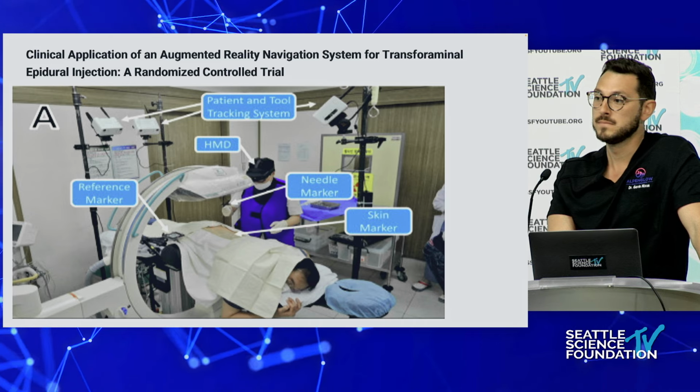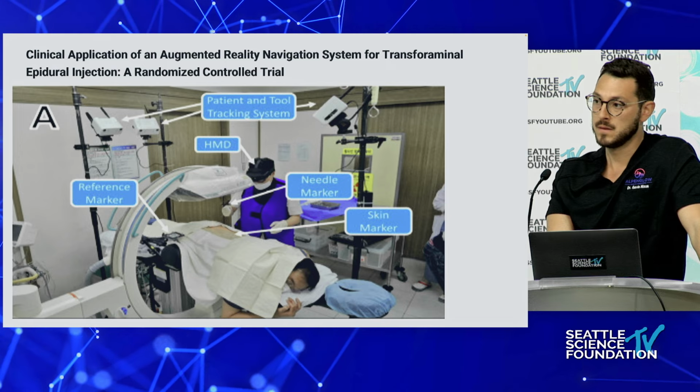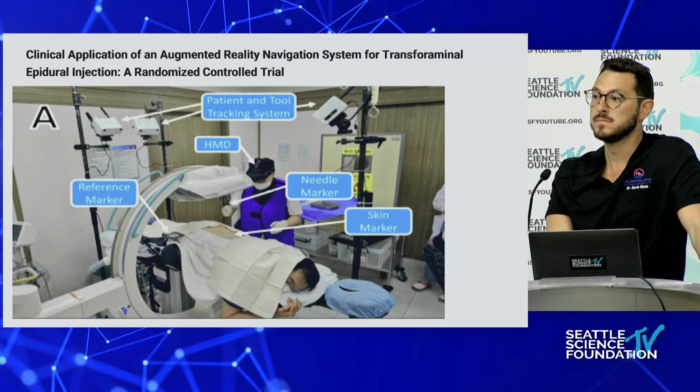The other use of this, besides pre-op planning, that I think is applicable, especially when COVID and other issues happen, is that education can go on. That's why we started the Med Ed Combine, so that when you couldn't go to society meetings, you could still have a scenario much like today, and people could watch online. We used our augmented teaching that way. It's great if you're a residency director and you have multiple sites, and you want to see what the fellows are doing. So I think there's a lot of educational benefits.